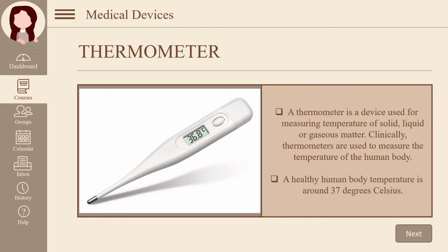For the first medical device, we have thermometer. What is a thermometer? A thermometer is a device used for measuring temperature of solid, liquid, or gaseous matter. Clinically, thermometers are used to measure the temperature of the human body.